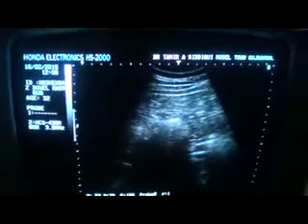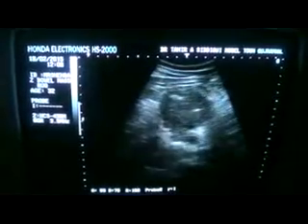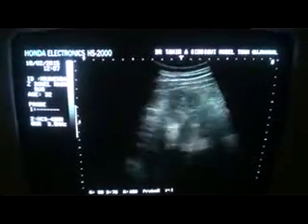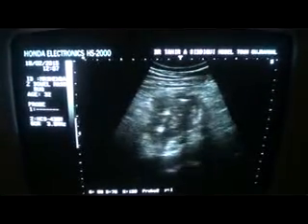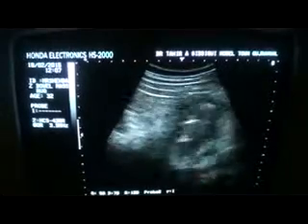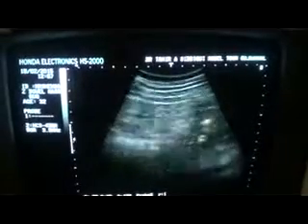This is an ultrasound study of a 32-year-old male with a history of right upper quadrant pain for the last few days. As I move the probe from the mid-subcostal region upward, you will see the liver, and as I move the probe downwards, I see a heterogeneous mass, extending from the region of the right hypochondrium down up to the para-umbilical region in a straight line.